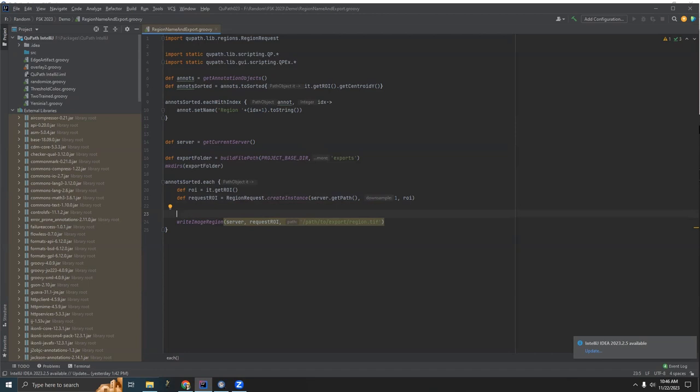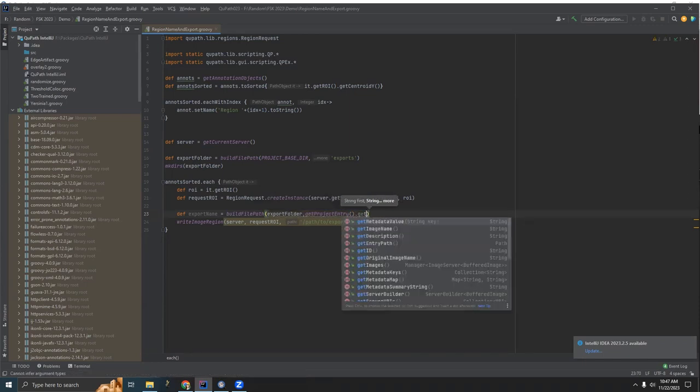And since that's going to be done inside the loop, I'm going to go def export name equals. Again, it's still build file path. And in this case, we can just call export folder to begin with. And it will take the whole path up until that moment. And then we need to figure out what the individual file is going to be called. And I think I want each file to be labeled with the name of the image and the name of the region. That way we can differentiate the top to bottom, and if we're going to run this for a project, we can differentiate which image we're looking at. So to get the image name, it is get project entry dot get image.